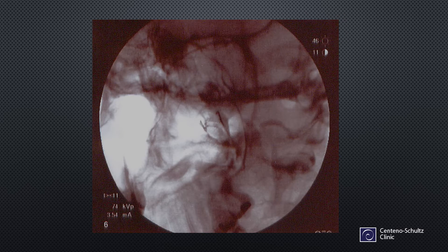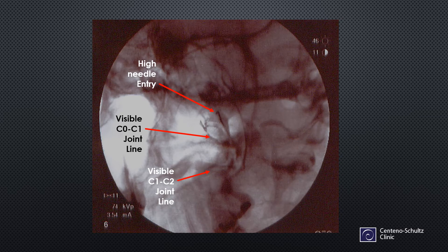Here we see a needle entering, and we can start to identify a few things. Down here is the visible C1C2 joint line. Right there is the visible C0C1 joint line, which is the bottom of the cup. And you can see a very high needle entry right there, which is basically where the Centeno technique goes in. It's a very reliable place to get into this joint and demonstrate contrast flow intra-articular.